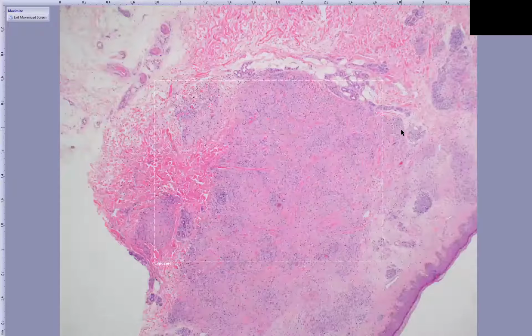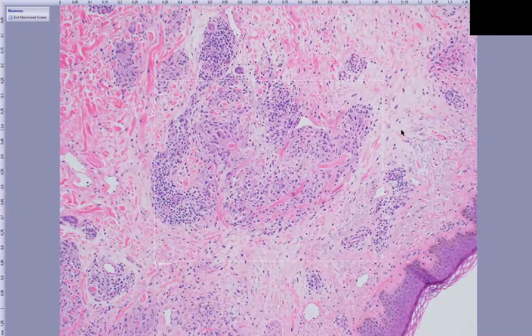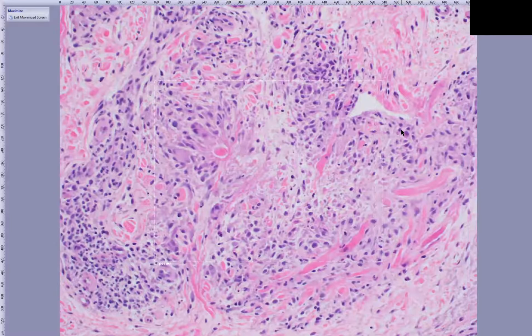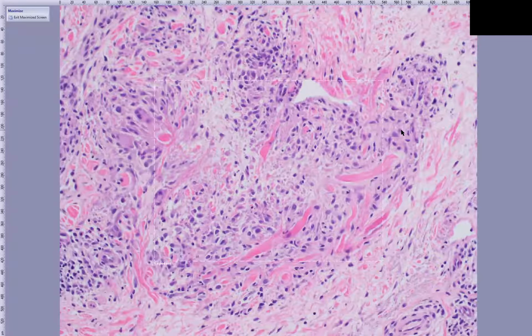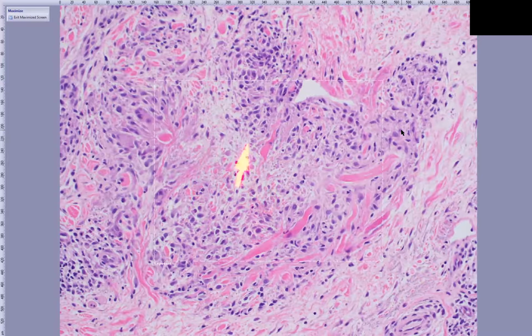These are called palisaded granulomas, and they're characteristic for GA, kind of the prototype for palisaded granuloma. And they can be small like this. The palisades are made up of these epithelioid histiocytes, once again, that have abundant eosinophilic cytoplasm. You can have giant cells in that infiltrate, but centrally there's usually increased white spaces between the collagen bundles in the middle of these palisades.